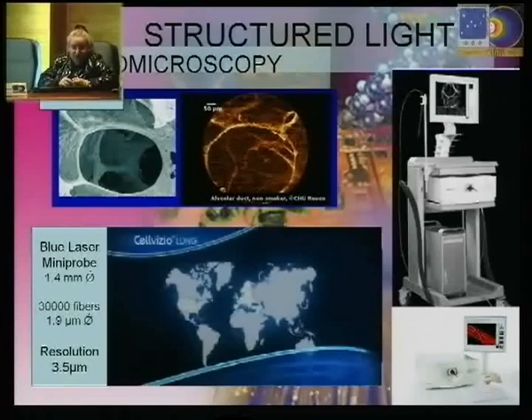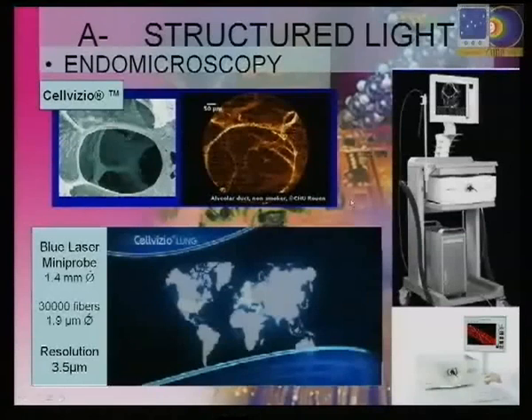Obviously now there are confocal probes in which there is only a single fiber. This single fiber has to have very high quality material in order not to spread and lose the light.